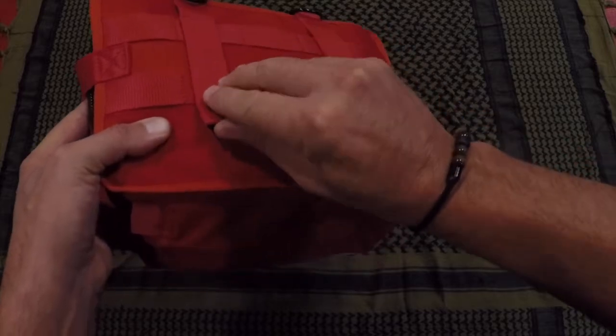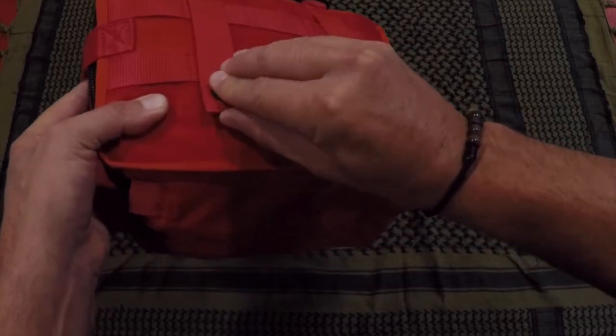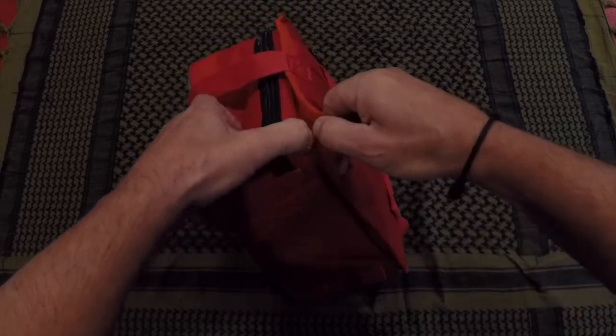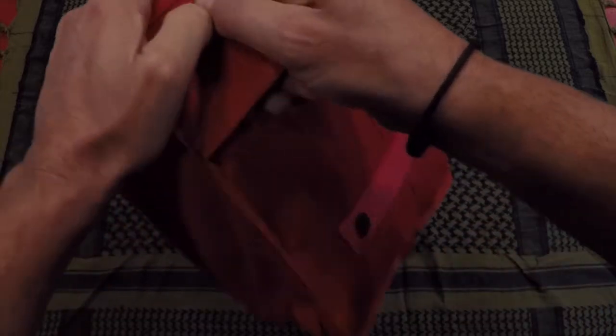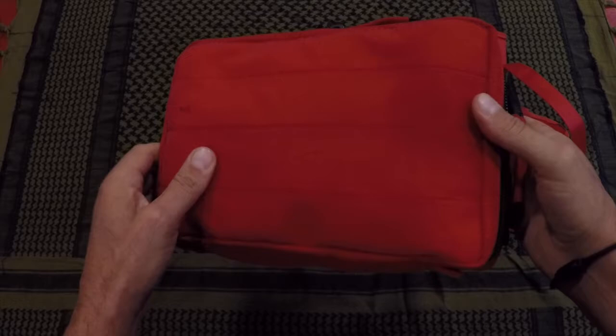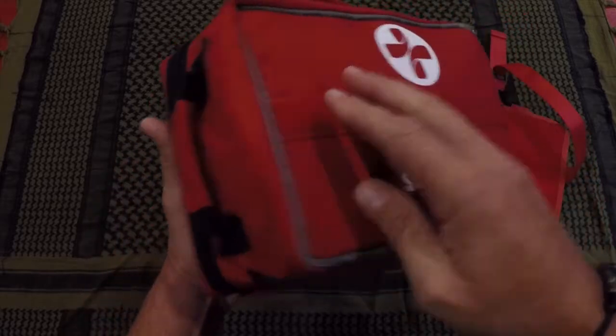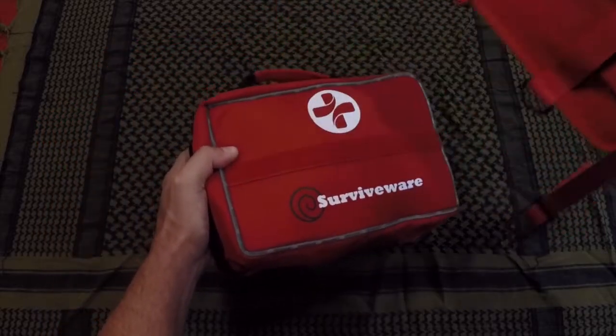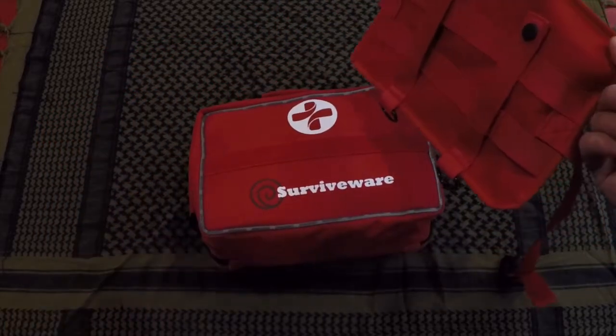There are various handles and straps here to attach to your pack or whatever gear you're utilizing. It also has this velcro setup where you can remove the backing and attach it to the back of a headrest in cars, in your trunk, things like that. When it comes to this case, the options and versatility are certainly there.